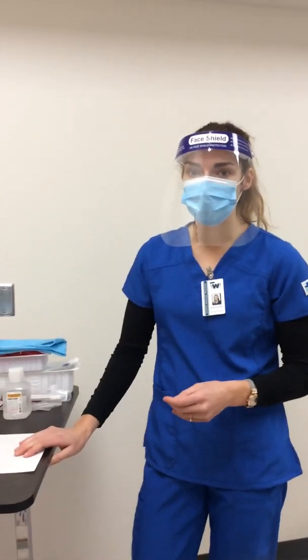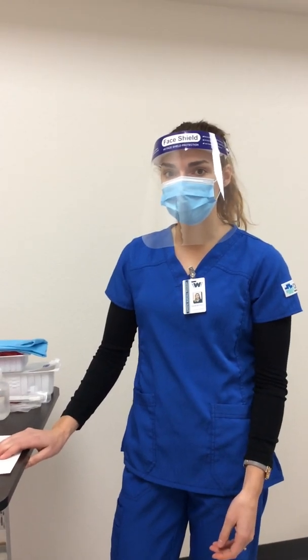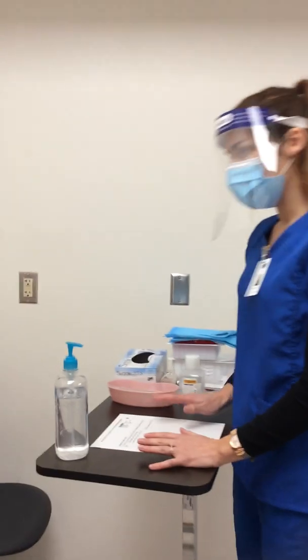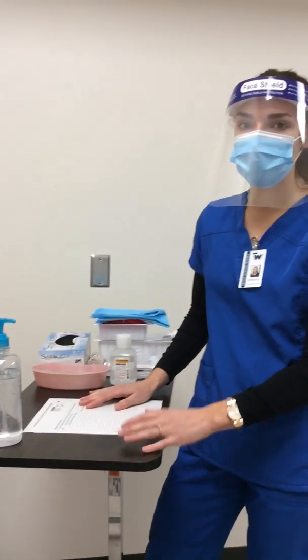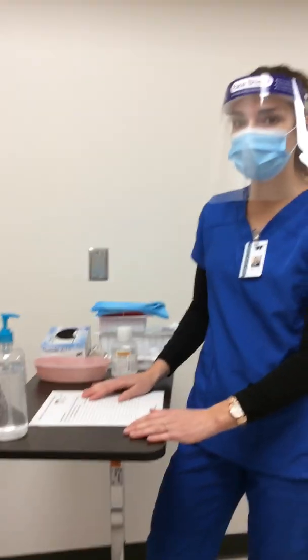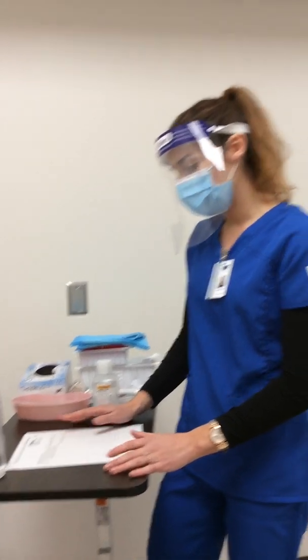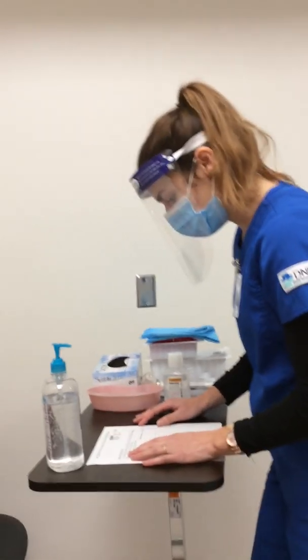Harmony. I'm a nursing student at Williston State College, and I'm going to show you wound care and how to wrap an ankle with an ACE wrap. I have already assessed the patient. Her pain level was at a 6 out of 10, so we gave her an as-needed pain management about 20 minutes ago. So I'm going to review the provider order for the wound dressing.